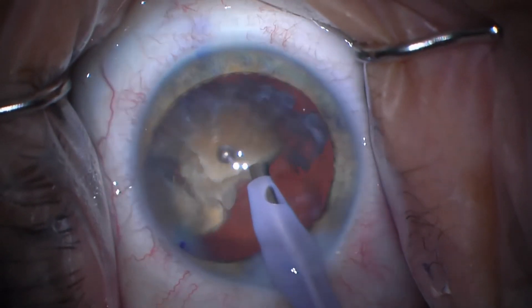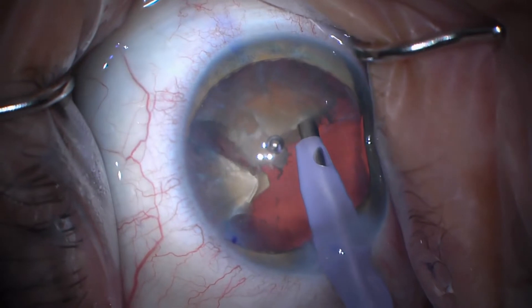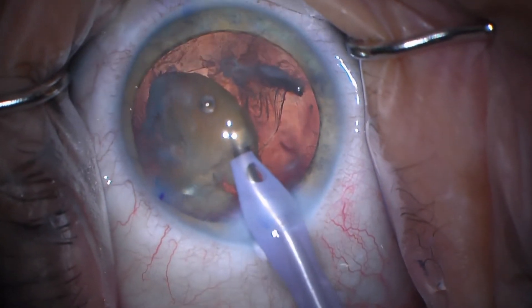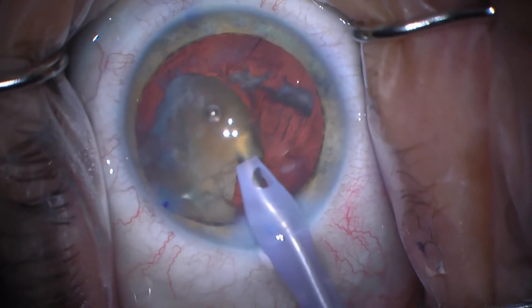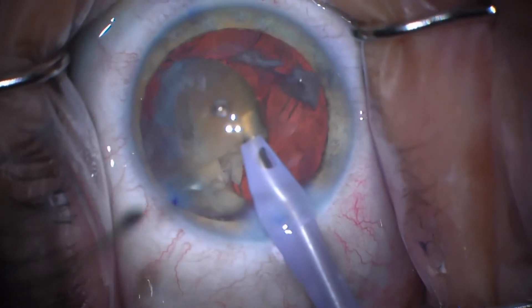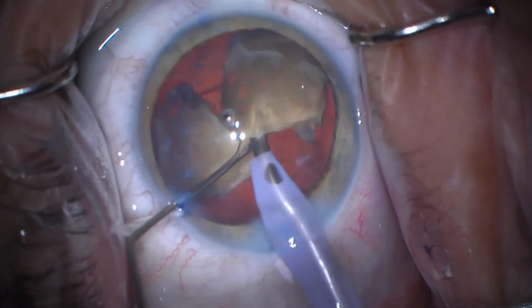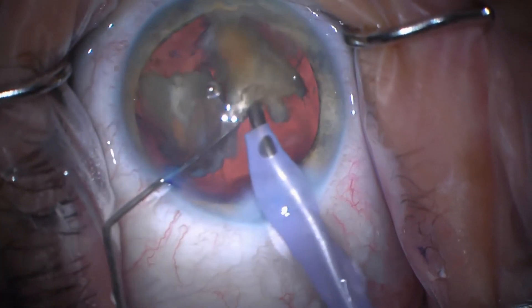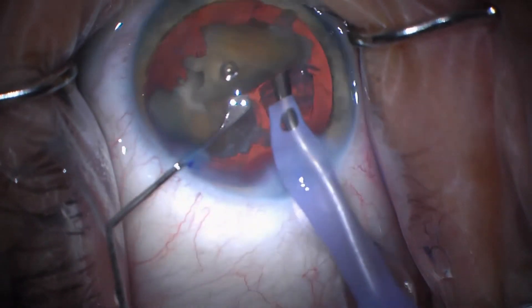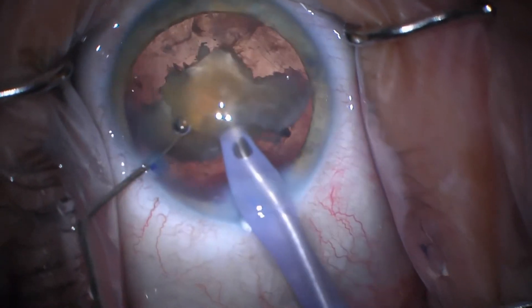But watch how long it takes me to get this big piece. If I just would have chopped this into two smaller pieces, the whole thing would have been much faster. You can see here it's not coming very well. The fluidics are off, so I'm going to take a second instrument here. And now the fluidics get worse because there's a second instrument introduced. I'm trying to get to the apex, but it's just not coming very well, and it's just because the piece was a little big.